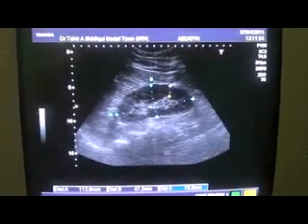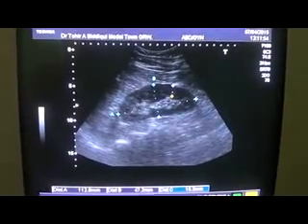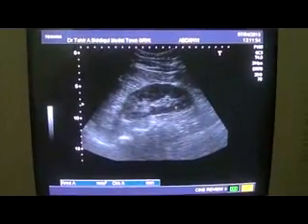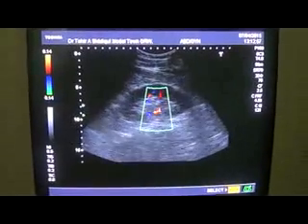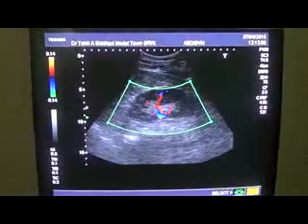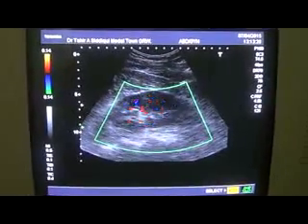Now this is in fact the left kidney in longitudinal section in front of you, measuring 11.2 centimeter in length and 4.7 centimeter in anteroposterior diameter, with parenchymal thickness of 15.3. Normal, everything is normal, nothing to worry about as regards the left kidney. The cortex is okay, and the pyramids are seen, with intact corticomedullary differentiation. When color Doppler is applied, I see that the parenchyma is being perfused well by the blood vessels.